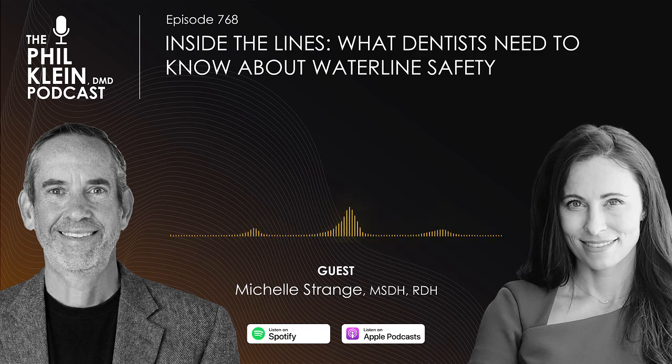So if you have not been testing at all, or it's been a while since you tested, the ADS's, the Association for Dental Safety's white paper talks about a minimum of 3 passing tests a month apart. So start here right now. You're going to get your baseline, pass or fail. And then 1 month later, we're going to do another test, another month later. So bam, 3 months in a row. If you pass on all of those, we can then go to quarterly testing. If you're failing and passing, I think you need to keep going until you get 3 monthly passes in a row. And then you go to that quarterly.